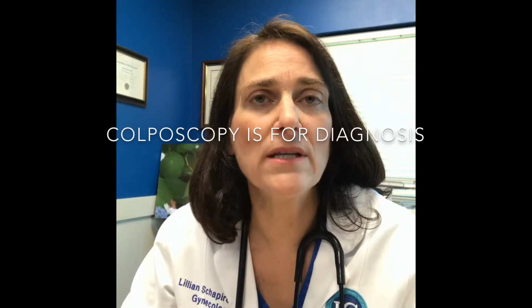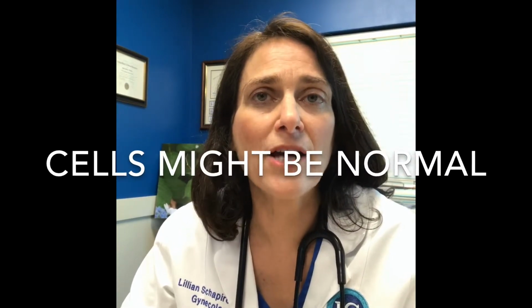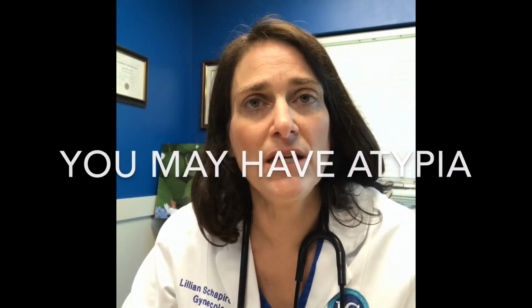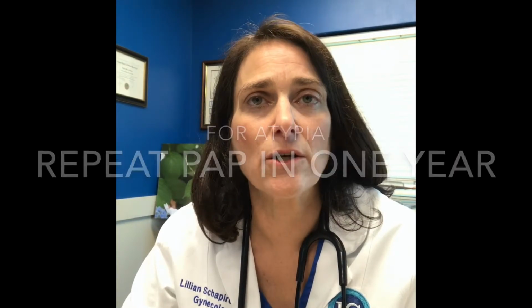So the colposcopy is to diagnose just how abnormal your cells are. Your colposcopy may actually come back showing that your cervical cells are normal, or it may come back showing that your cervical cells have atypia. In that case, we generally just repeat the pap smear in 1 year.